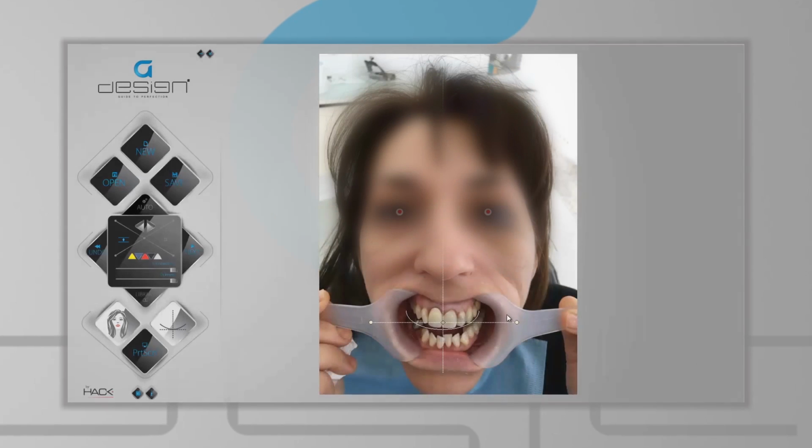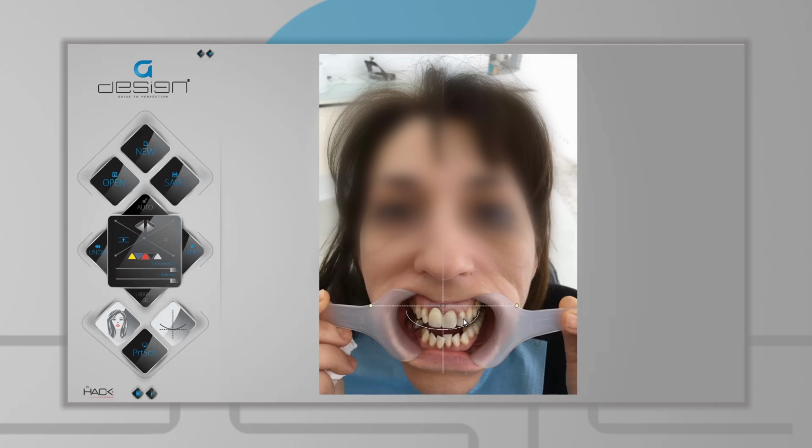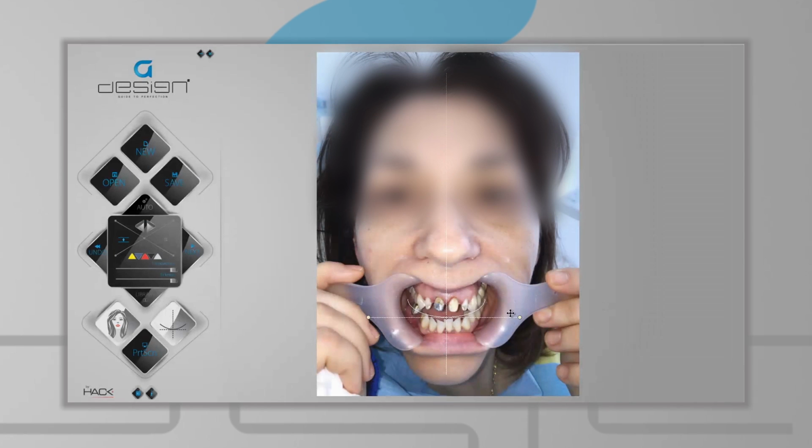Surgery. Following aesthetical principles, G-Design is the ideal instrument in guiding a gingivectomy. Checkup. The application can also help check the results and their accuracy.